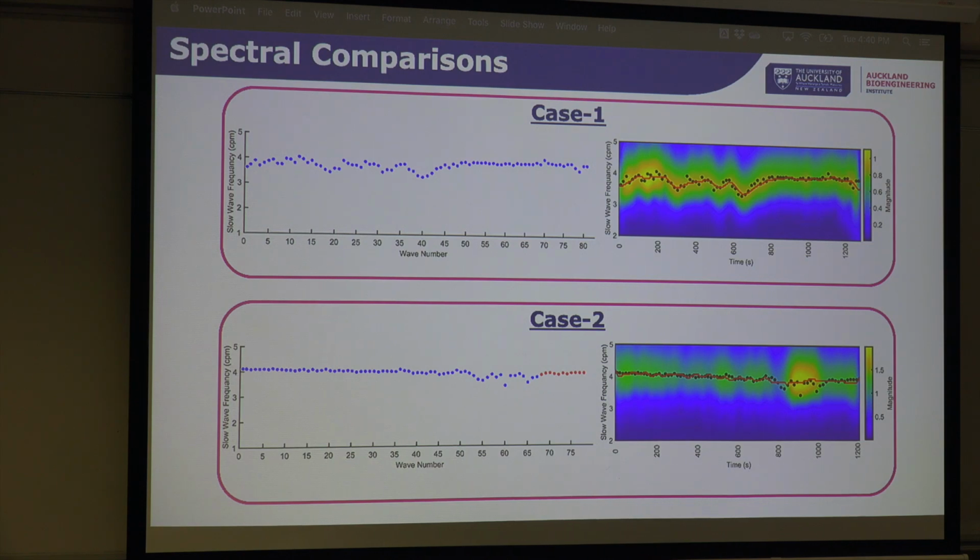And so the EGG was able to very closely follow the changes to the serosal frequency. This is a big step forward, as this has not previously been able to be done in the EGG, where they normally look at periods of 4 minutes. Here we can tell to nearly 5-second accuracy what the serosal frequency was doing.